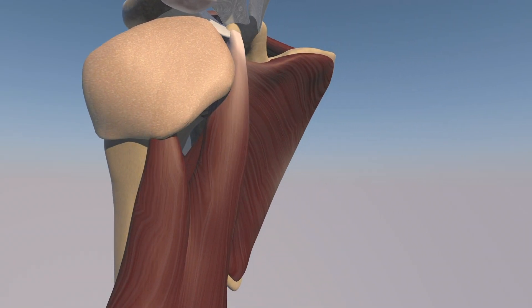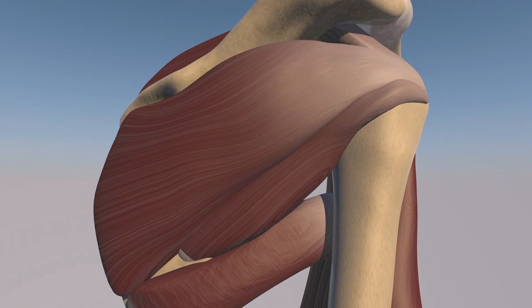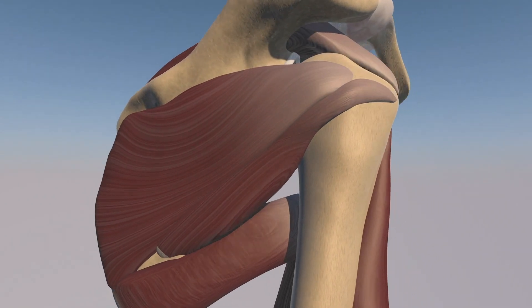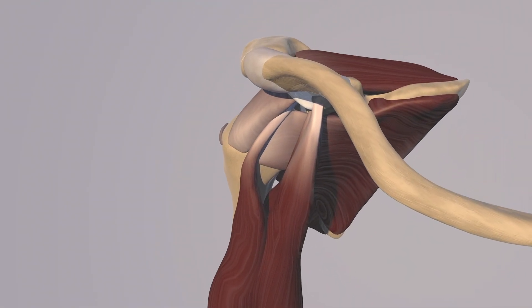Here we are looking at a normal shoulder with the subdeltoid bursa wrapping around the cuff. And now we're going to remove the subdeltoid bursa. This patient has a high grade tear of the infraspinatus tendon, I believe with a full thickness component as well.